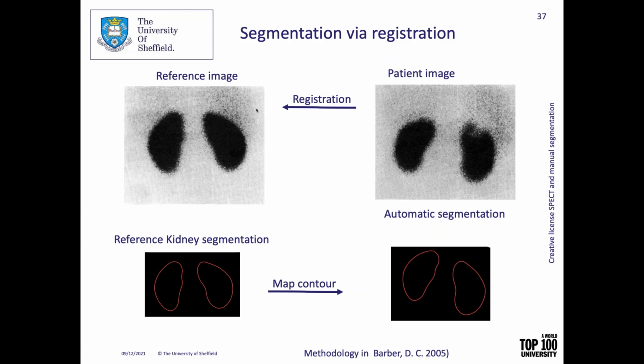and in time, with new images, new scans of the patient, you want to realign the images and compare the size of the tumor. In this case, we're talking about the kidney. So we have a reference patient. Assuming this is the golden standard to segment this kidney, then comes a new patient, or a patient at a different time step. This is the following scan.